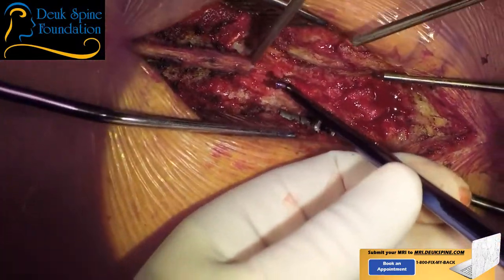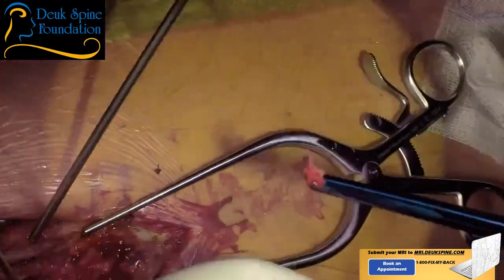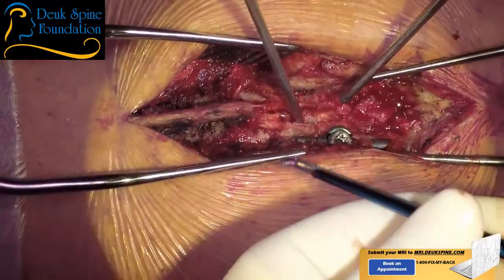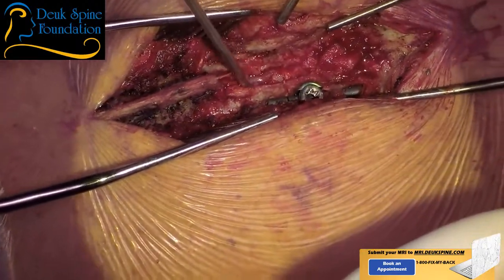Help me. Don't push down at all, because it's not the lumbar spine. Look at all that thickened ligament. This is what was pinching on the MRI. I forgot to show you. In the back of the spinal cord, right here, is ligament that's pushing into the spinal cord.